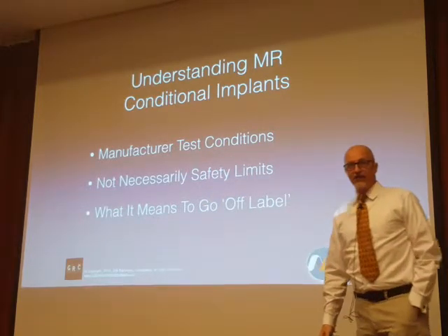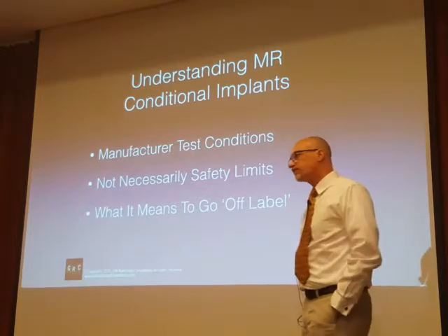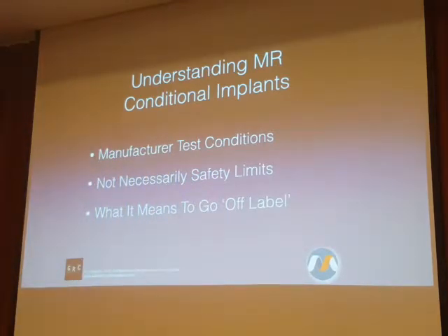So let's transition to MR conditional labeling and MR conditional implants. When a manufacturer submits their implant to get MR conditional labeling, in the US at least, the FDA is the organization that approves MR conditional labeling. And they have some general standards about how you're supposed to conduct the test to get the data that demonstrates that the product is safe. So the test parameters are pretty well defined.